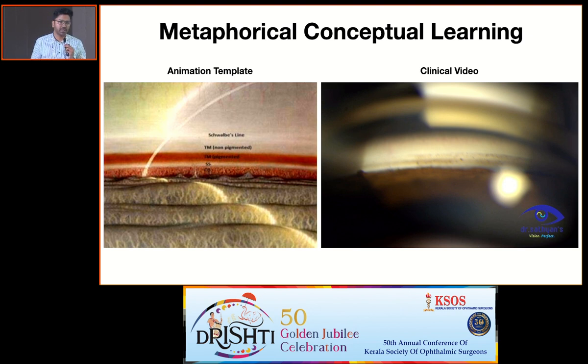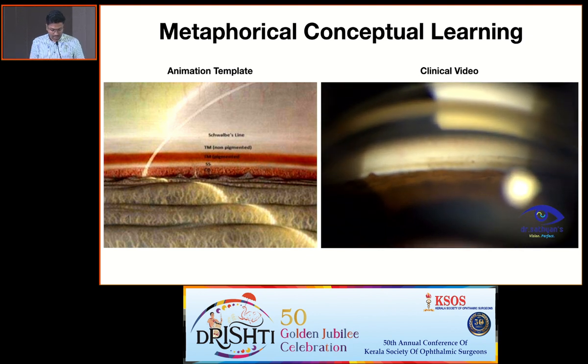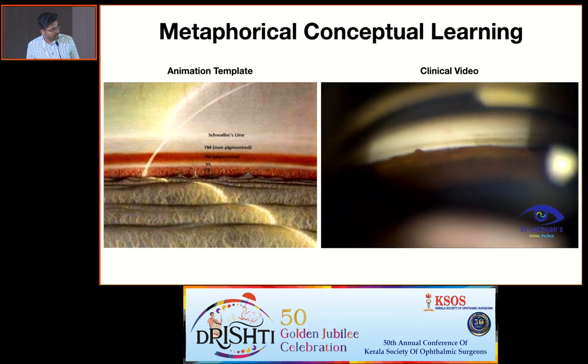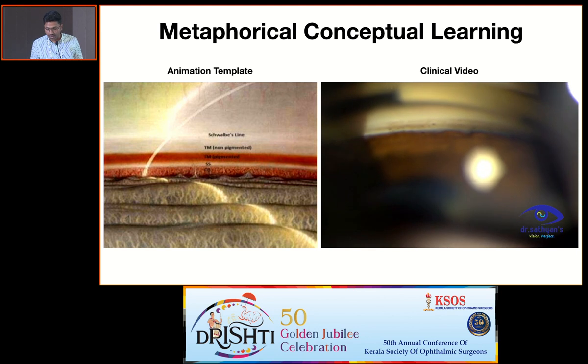To become an ophthalmologist, the basic training should be more focused towards how to see the angle. It's a most complicated process, and then how to see the fundus. We will be demonstrating the animated template and then the clinical video along with it, so that people who are analyzing this can easily see the angle structures and appreciate them, which is actually a little confusing at the beginning of your residency.